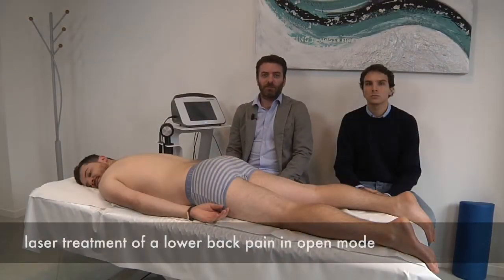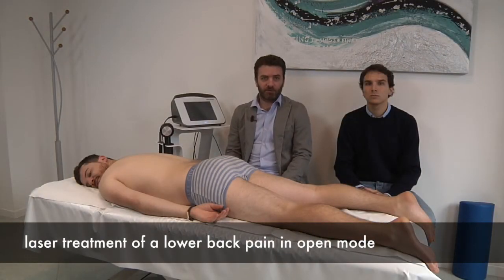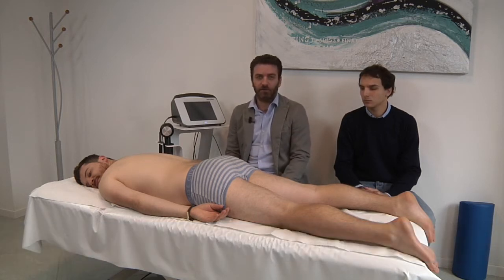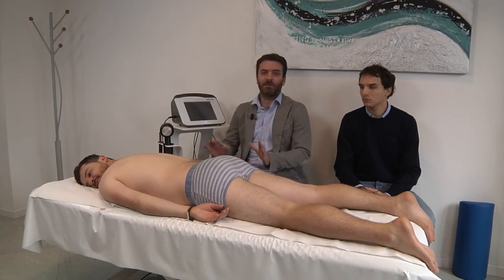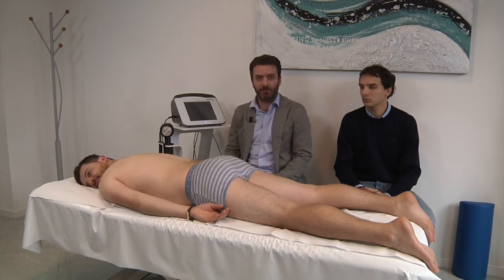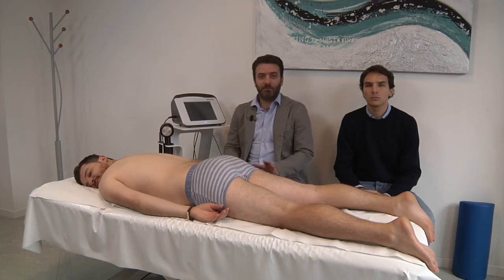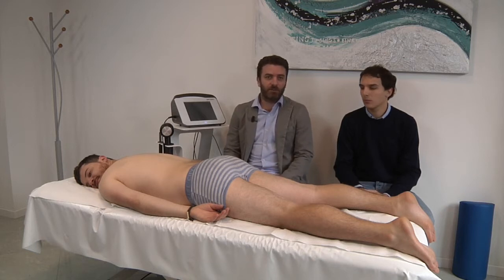Now we simulate the treatment of a patient with lower back pain, with an irradiation in the right foot. The area is located in L5 on the right. We have available a test that tells us that there is a paramedian right slipped disc at the L4 to L5 level with intraforaminal commitment. In the clinical evaluation, we have essentially established 3 treatment grounds.